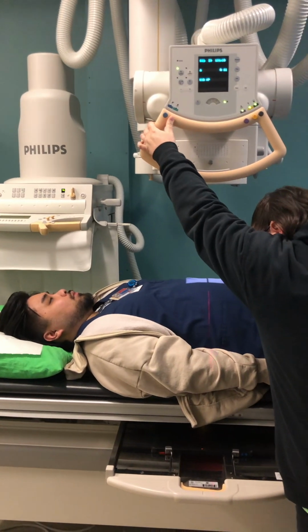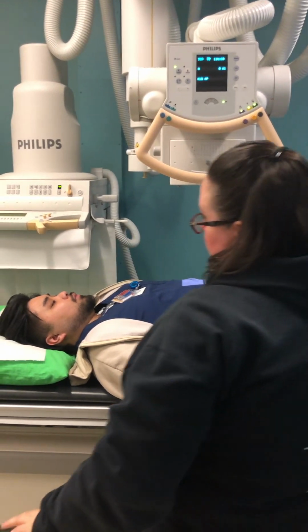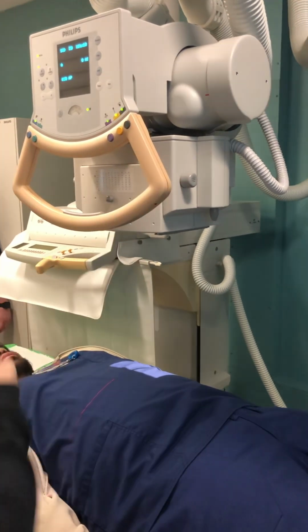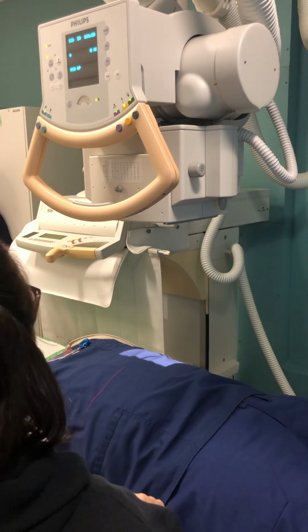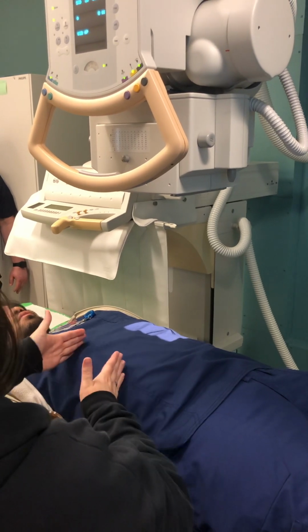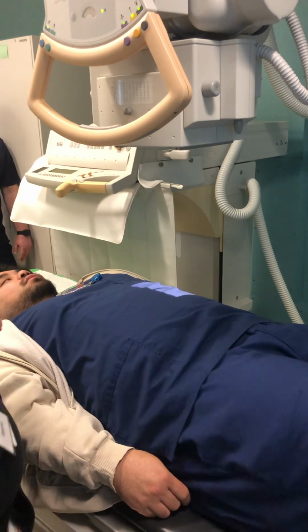Are these always going to be on the table, or can you do this erect as well? So, according to your textbook, they should always be on the table. Why should they always be on the table? It's something to do with the diaphragm. So, gravity helps push the diaphragm further up, so that you have a more uniform density below the diaphragm.